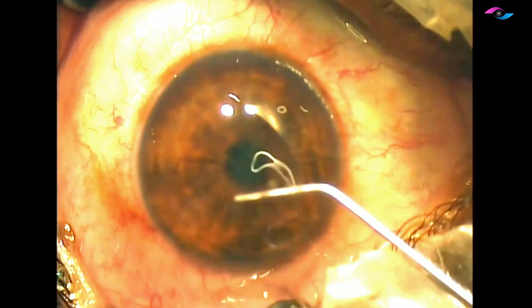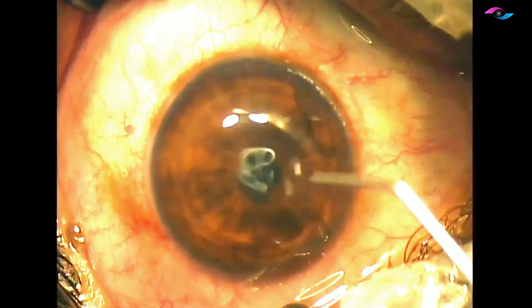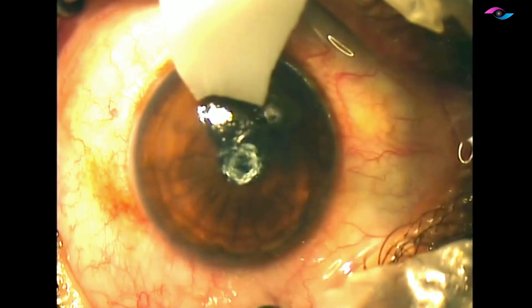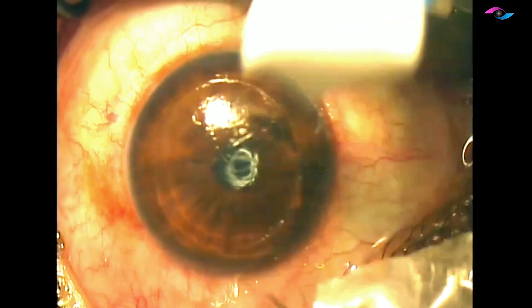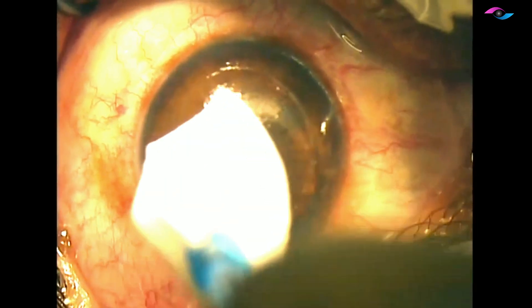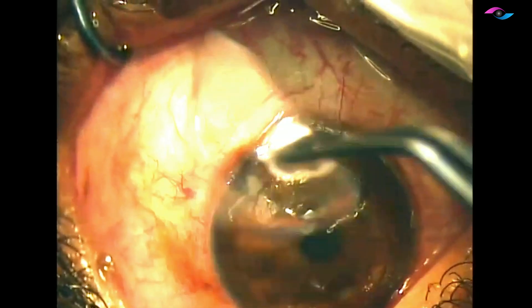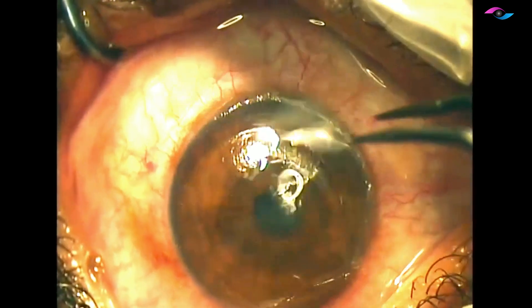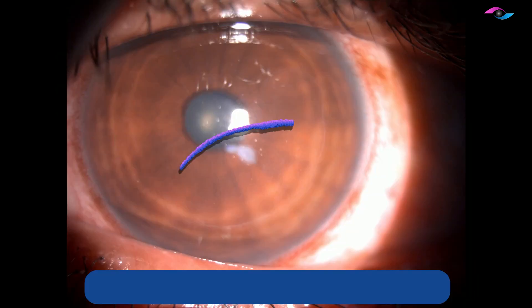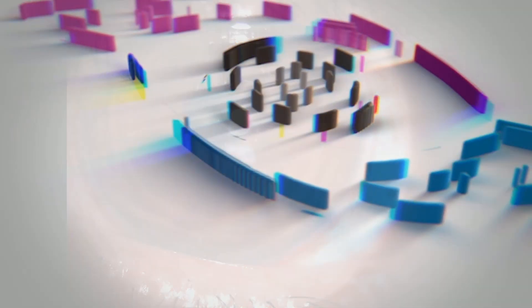We then wash the interface very thoroughly, and gently and slowly replace the flap back in position, iron it out, and leave it for a period of two minutes to let it stick back. After two minutes, once we have a nicely opposed dry flap, we paste a bandage contact lens and instill steroid as well as antibiotic eye drops. This is the first day post-surgery — we can see a clear cornea. Thank you for your attention.